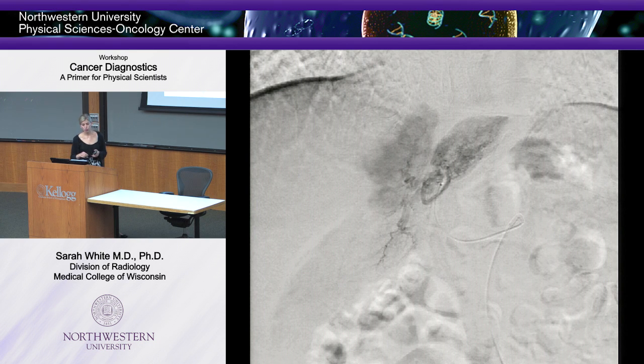And so before we do that, we just want to make sure that there's nothing else that we're going to kill. The stomach doesn't like radiation, okay? So we do a scan first, and then we inject MAA, which is basically sort of like a dry run. It's a radioactive material that won't kill anything, but it'll tell us where that's going to go. Is it going to go to the stomach? Is there going to be a shunt to the lung? Because sometimes the liver has these shunts that go to the lung. So we injected MAA.